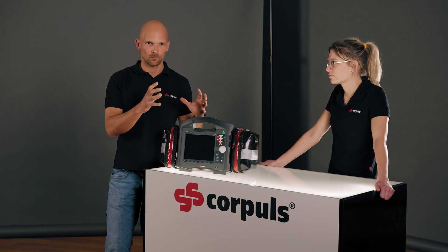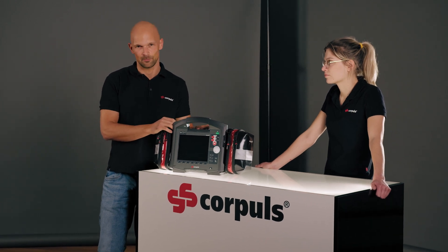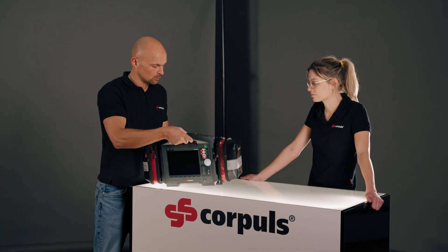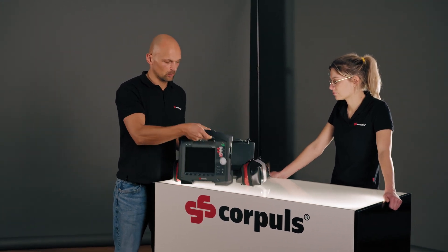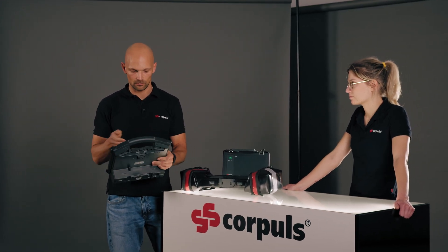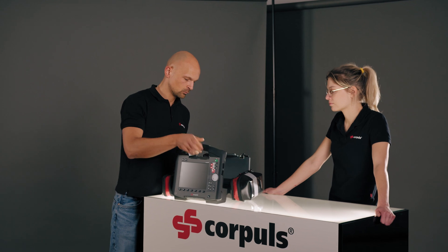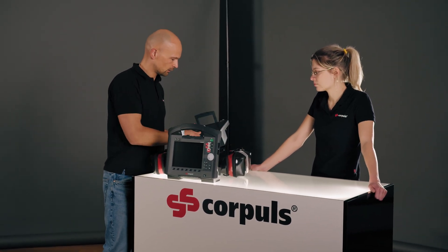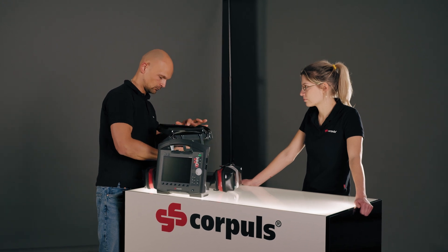I'll now divide the device into its three parts and carry out a quick visual inspection of the individual modules, paying attention to any external damage, chips or cracks. It doesn't seem to be a problem, and everything looks as it should.